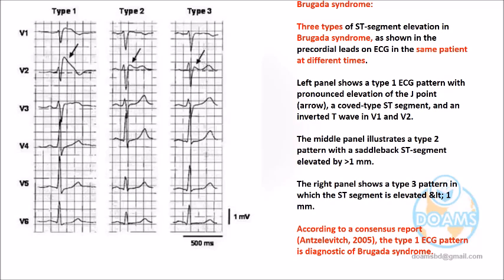But such a patient does not have chest pain. Rather, what will the patient have? The patient will have features of arrhythmia. So if arrhythmia is there, how does the patient present, with pain or palpitation? Palpitation. If a patient with palpitation has such ST elevation in the lead, it will be termed Brugada syndrome. There may be a lot of discussion about type 1, type 2, type 3, but for a GP or internist, we are not cardiologists, so remember at minimum the very typical one.